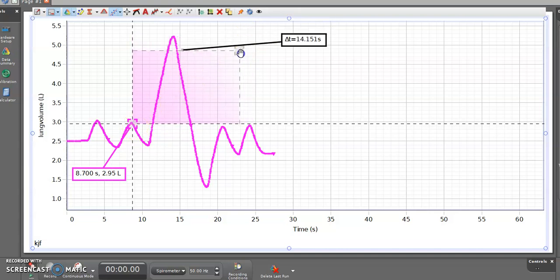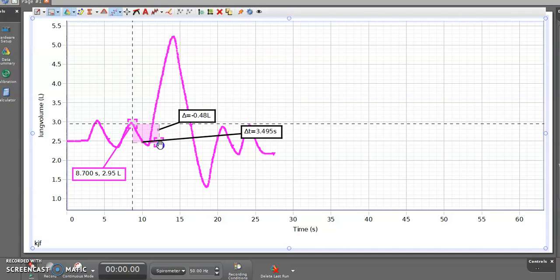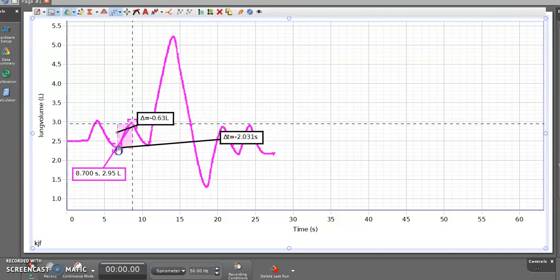And then I'm going to drop this down to the matching valley next to that peak. So I'm going to have a difference here. Now I'm able to actually read this, and this would be what you would be doing if you were in lab, but you could read it on the computer.